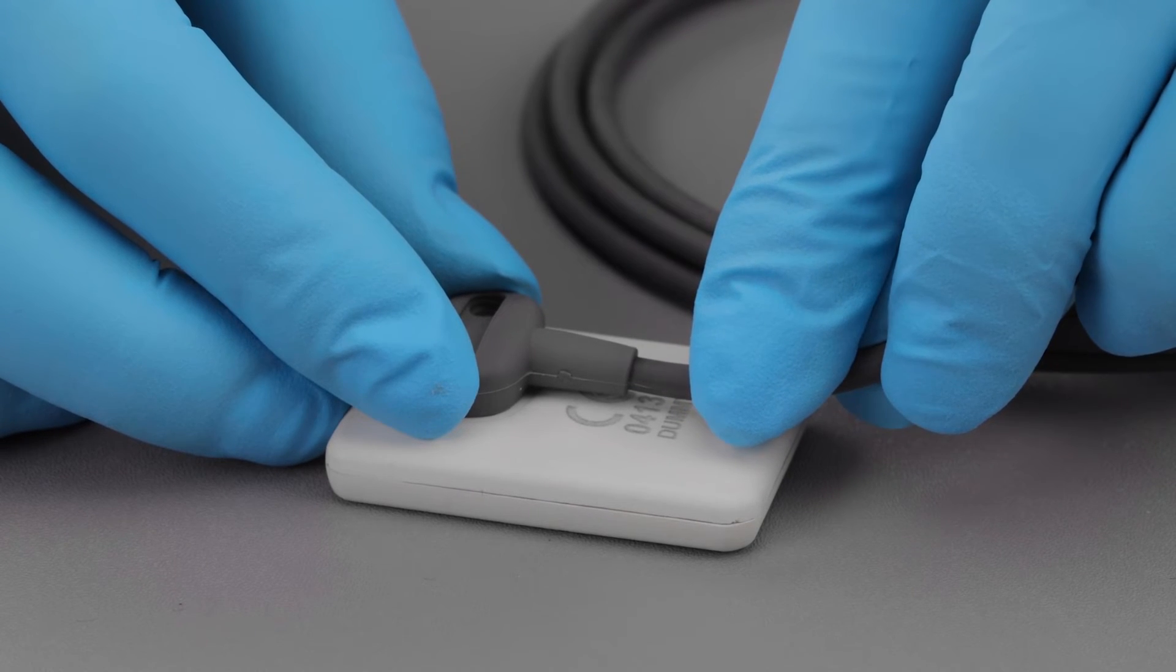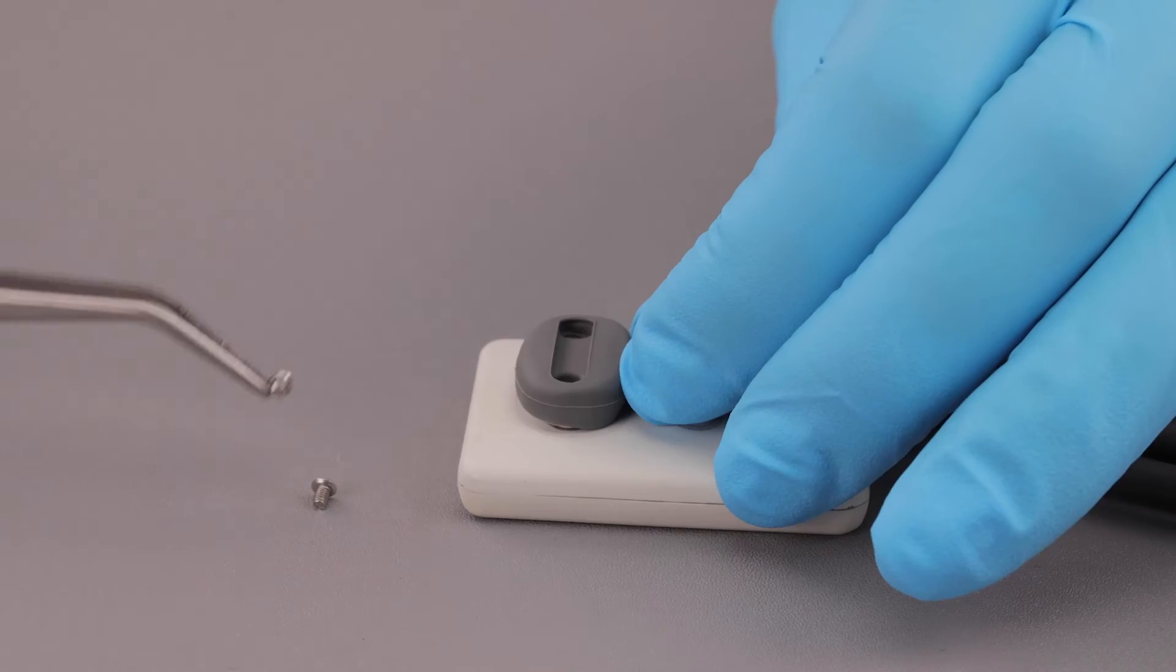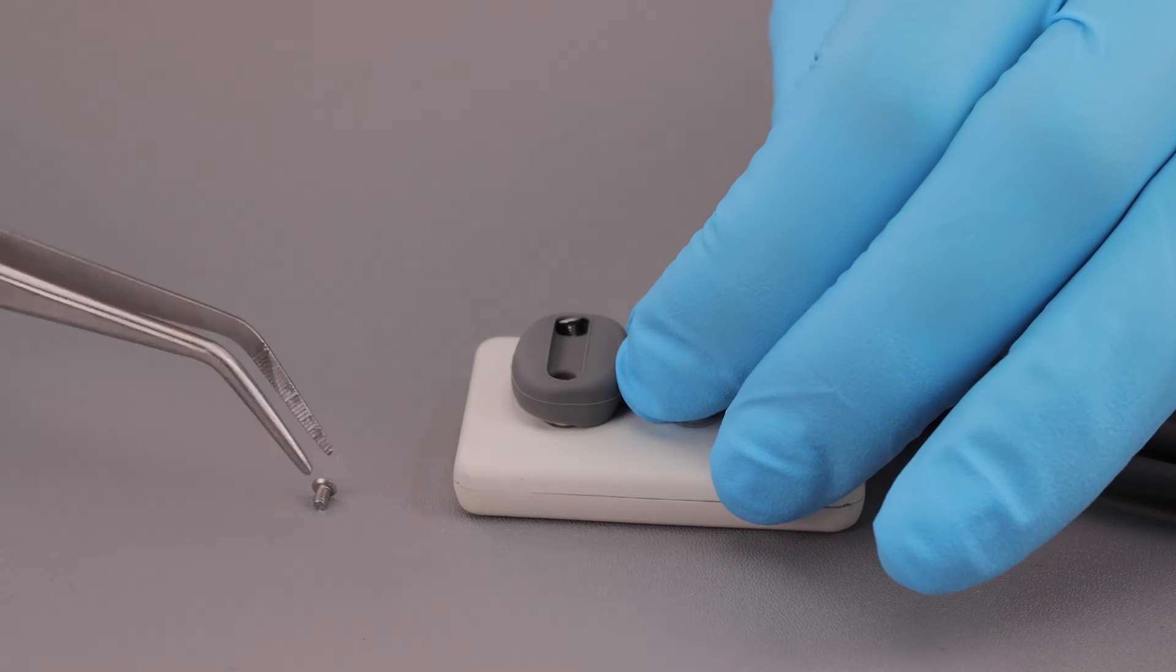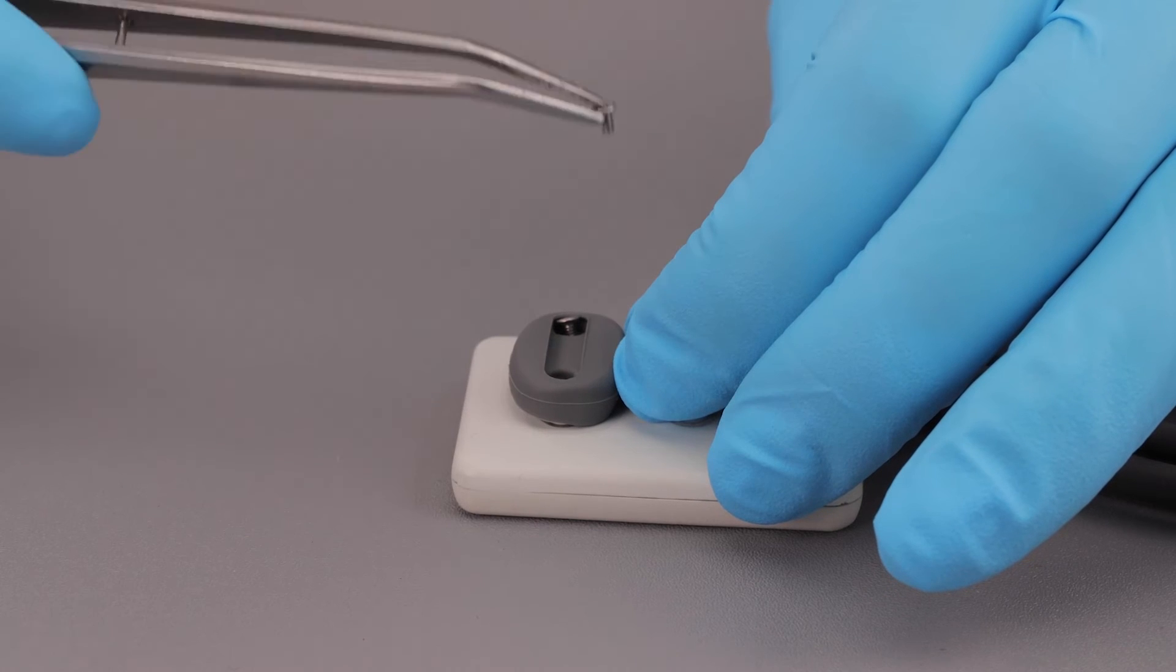When properly aligned, the cable will fit in the back of the sensor evenly and the metal area will be completely covered. Remove the two new screws from the kit.